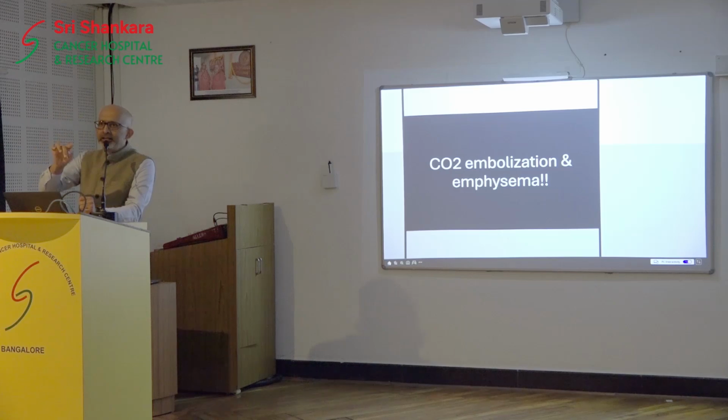And typically, if embolization has to happen, the EtCO2 drops. That is what happens. Any anesthetist here? I think, sir, you are an anesthetist, right? Yeah, so you would also be able to tell you, but the typical feature of an embolization is a drop in EtCO2. So here, the moment you see a rise in EtCO2, you need to act.